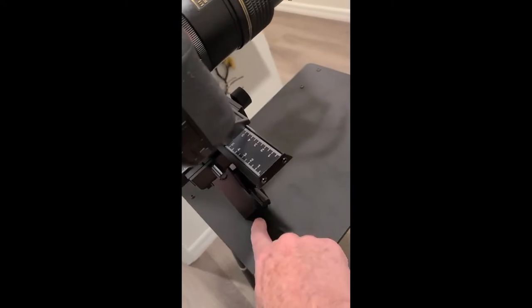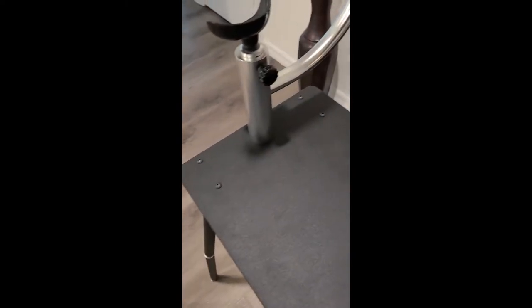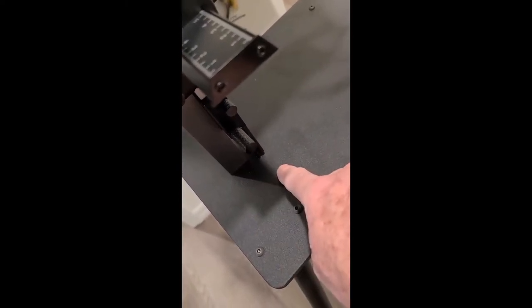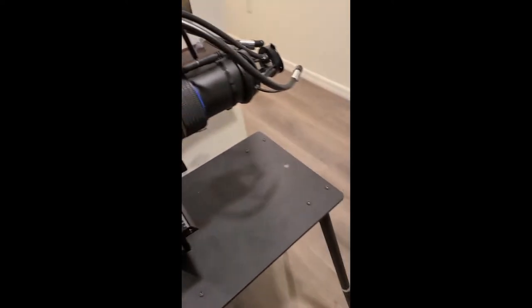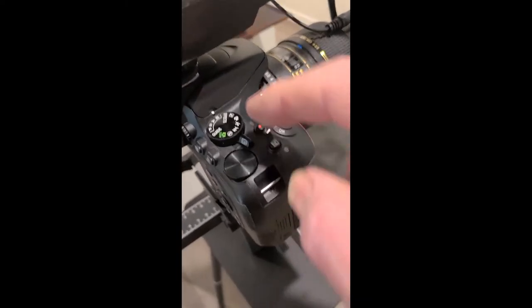The next thing to pay attention to is setting up the camera system itself. We have a couple of holes — this one right here has a bolt underneath it that holds this section in place. There's another hole up here which holds the face mount. The hole closer to the center holds the actual camera and macro focusing rail. The one further out holds the face plate.